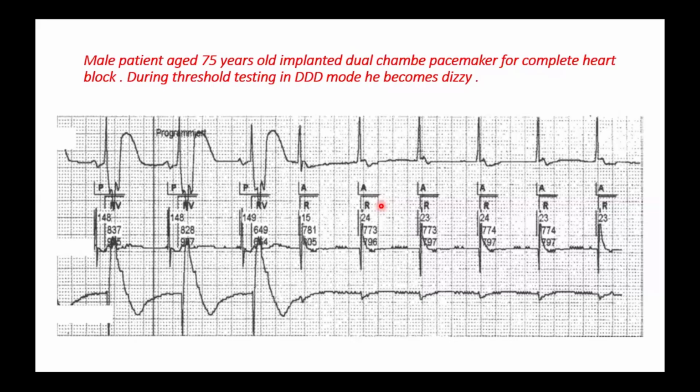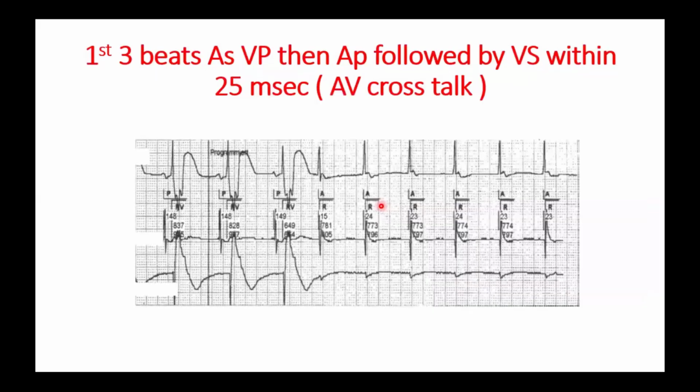Sometimes some engineers made this mistake, maybe 3-4 times throughout my life. When they go to test a patient with complete heart block for atrial pacing threshold, they go to AAI mode, and this stops ventricular activity, and the patient would scream from headache, from stoppage of pacing, and would say, "Get this man away from me! Take this man away from me!" So very dangerous.